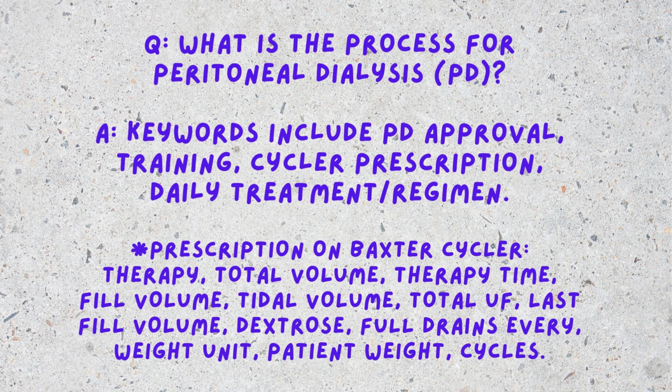And you also need to check your dialysis fluid every morning when you collect during the night. It needs to be clear. You need to be able to see. It's kind of like light pee, but really light. You should be able to read through it. So if it's cloudy, pinkish, if it's just looking off, then you need to call your nurse because that could be signs of peritonitis.